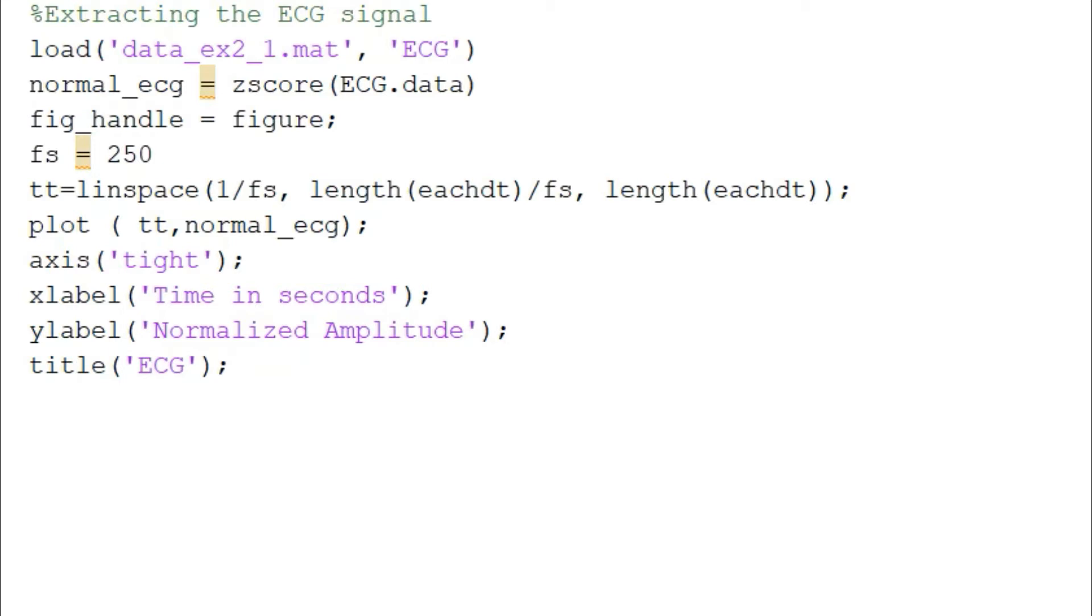There is one more thing that I have mentioned over here which is fig_handle. We will see the use of this line in the future code segment.